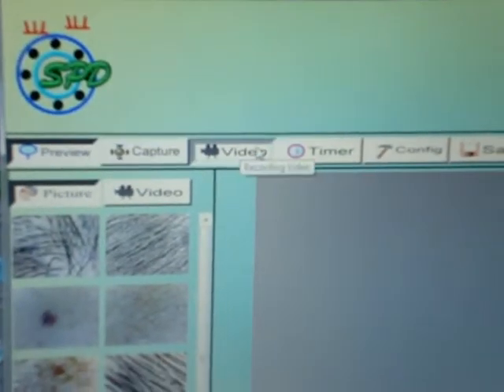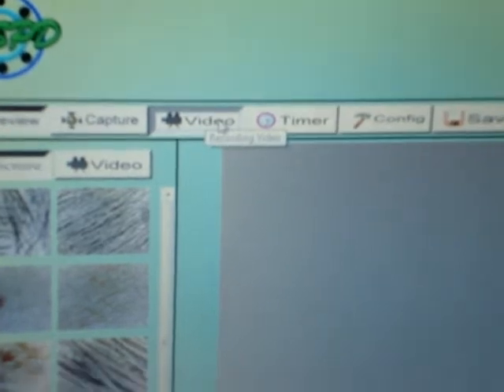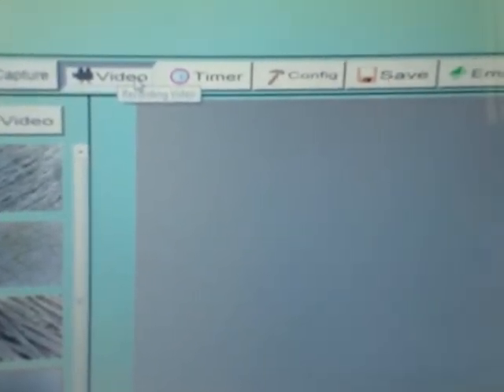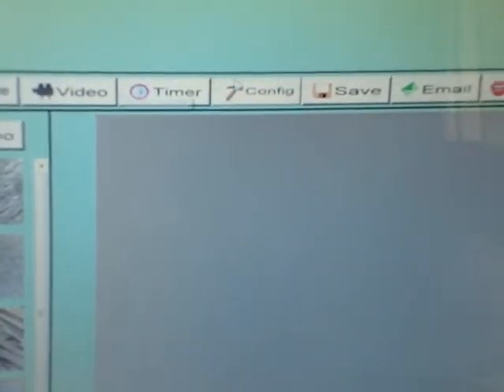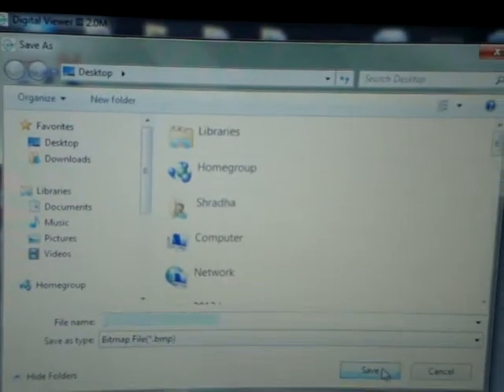Videos can be taken by clicking on the video icon. Images can be saved in a folder on the laptop or desktop by clicking on the save icon.